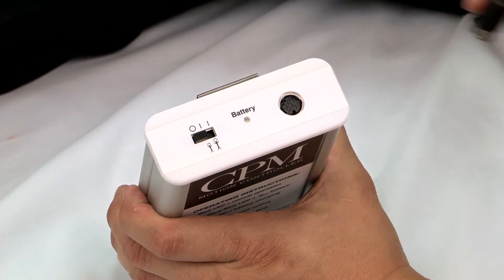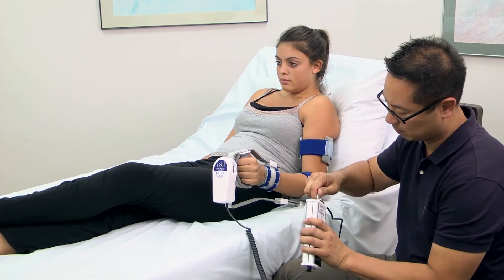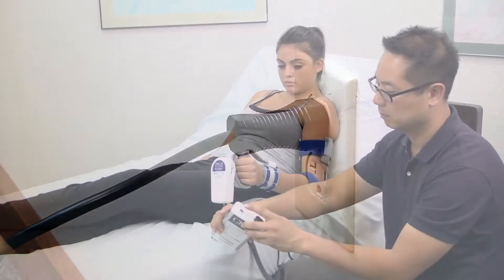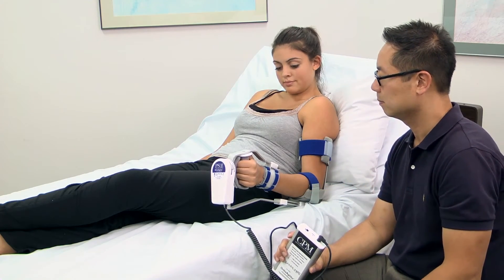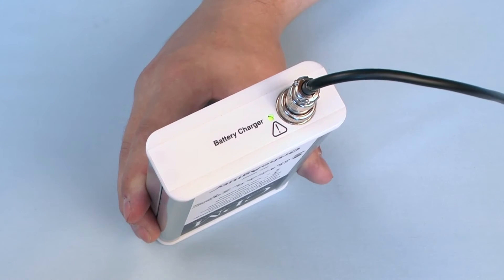Next, plug the PS1 into the CPM controller. Then plug the power supply into the CPM controller and into a grounded wall receptacle. The CPM controller is rechargeable — on a six to eight hour charge, the controller will operate the PS1 for up to 100 hours.